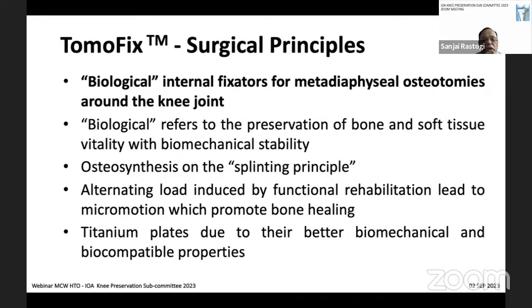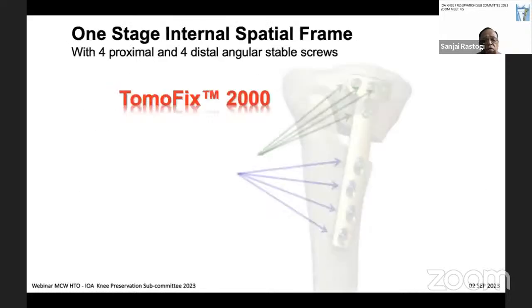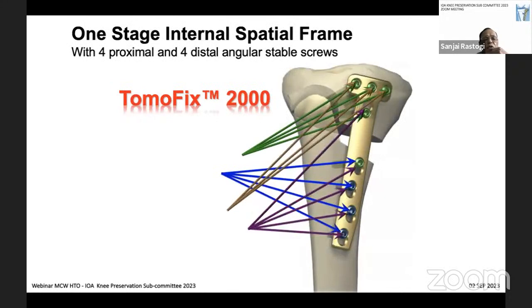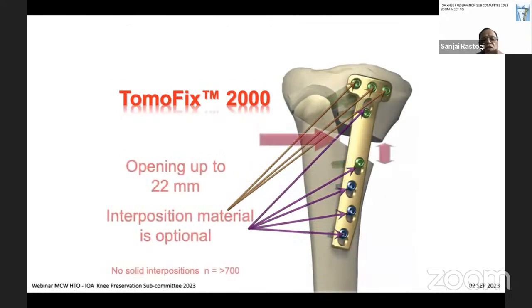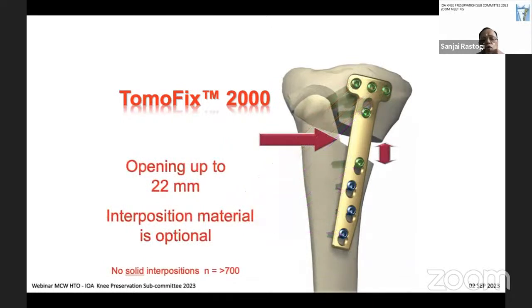It is based on splinting principles, and that's the reason alternate load bearing with a functional rehab leads to micro motion and promotes bone healing. This is made of titanium because it's biomechanically and biologically compatible. Now, this fixator is a one-stage internal spatial frame, which has four proximal and four distal locking head screws, and it allows opening up to 22 millimeters.